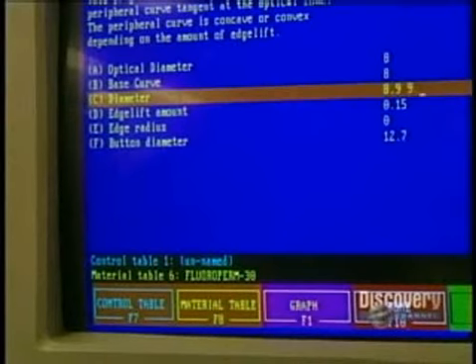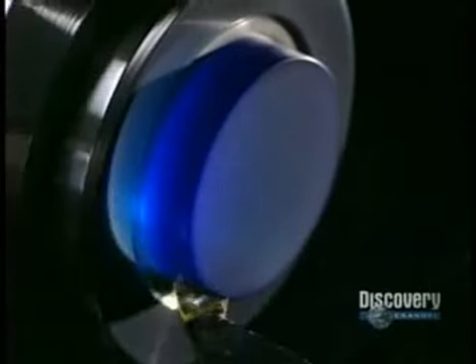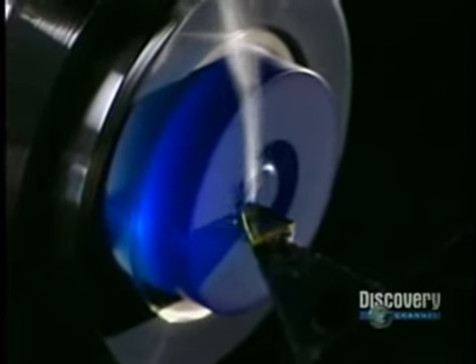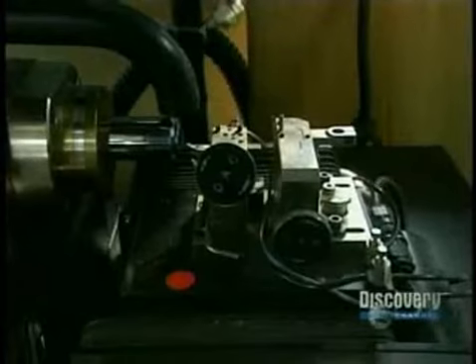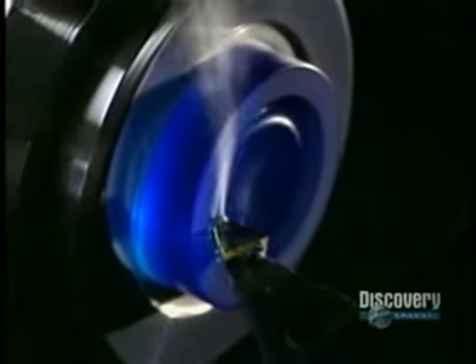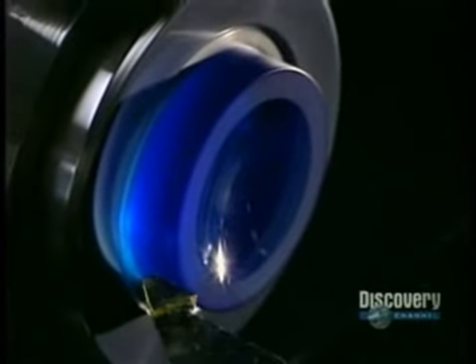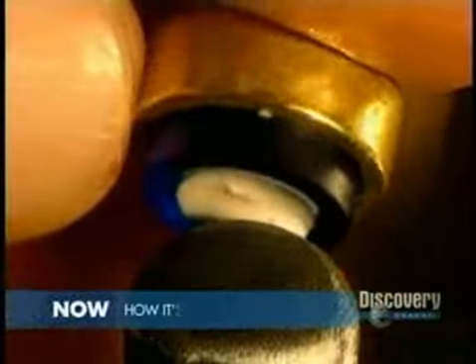The process begins with the data processing control of the shaping. Data is supplied by a computer, which controls a digital lathe. They begin by shaping the inner curvature of the lens. This digital lathe, rotating at 6,000 revolutions per minute, is equipped with an industrial diamond. It shapes the inner surface, the part that touches the cornea.